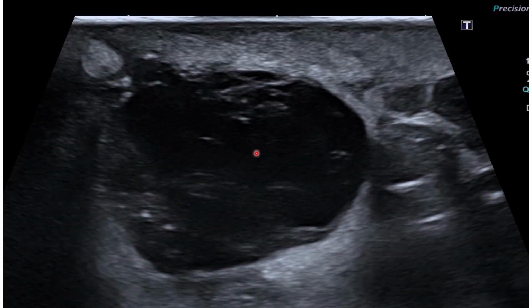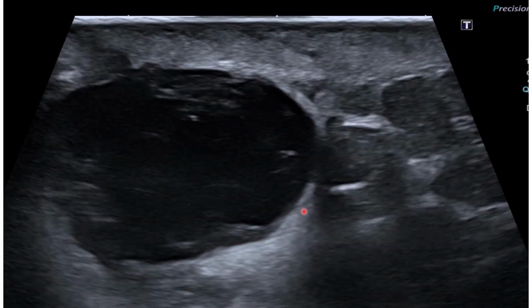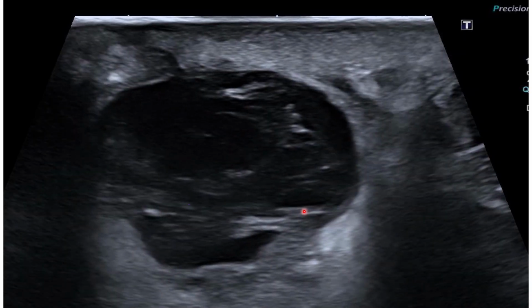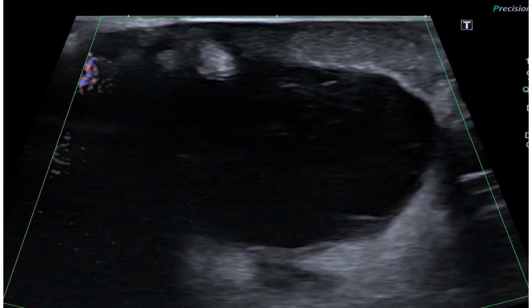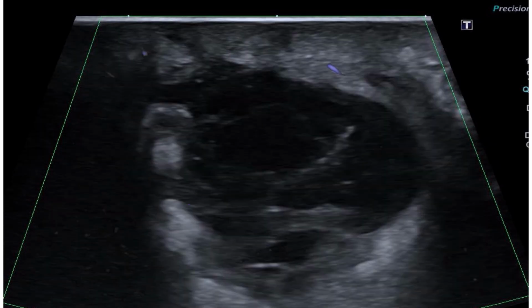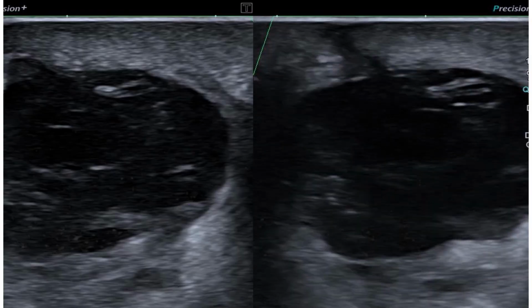I hope it's making sense to you. MSK is one of those areas which is quite interesting and which most people are not interested in. You can see I also tried to use microvascular imaging to pick the smallest signals and amplify them, so that we can see if there's perfusion there, but there's no perfusion whatsoever. This basically puts a no to an abscess.